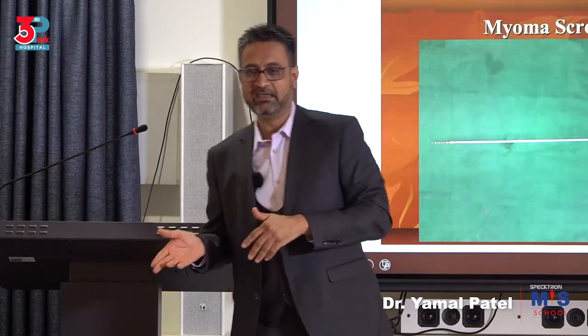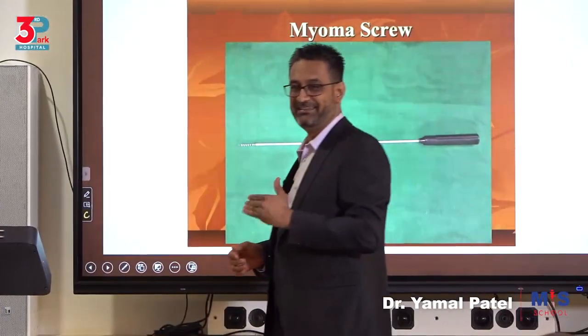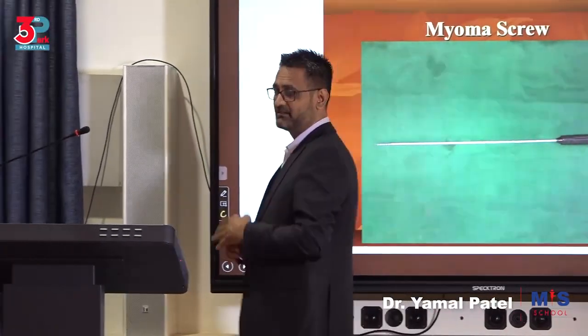So when you're doing suturing very frequently, then you have to be careful with what positioning you maintain. So now I am an ipsilateral surgeon, but I used to be contralateral in the past, and that's very many years ago, over 15 years ago, I used to still do contralateral suturing. So maybe we'll teach you and we'll explain the benefits of each. Why one over the other, or how do you decide which one to go for?